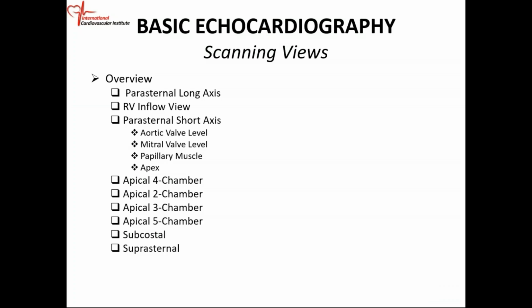So again, scanning views is basically what you're going to do with your transducer in order to get an image. This is how you're going to scan the heart. What you need to do is go over this session thoroughly, and then once you start scanning, you need to develop a routine for how you go about scanning.